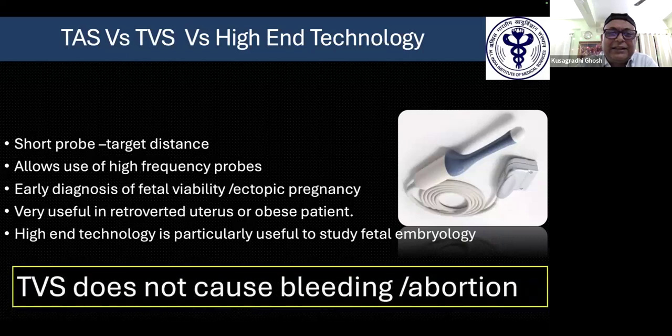So I think in the guideline, or in discussion somewhere, it might be mentioned that it's better to do a transabdominal scan and assess the lower abdomen before actually putting in a probe inside. Now, of the two, the abdominal scan does not need any counseling as such, because patients really know that they're coming for an ultrasound and that the lower abdomen will be exposed.